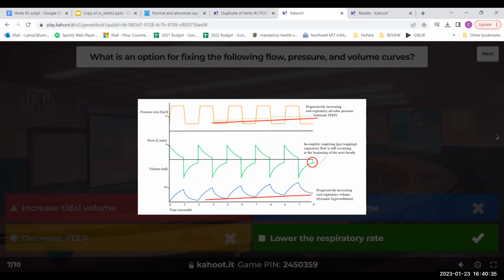When you set the respiratory rate to 20 and you tell the ventilator to give a second for the patient to inspire, how much time are you giving them to expire per breath? A little bit of math, but not very complicated. Anyone? The 2 seconds? Yes. So 2 + 1 would be 3 times 20. It's 60 seconds, which is the number of seconds in a minute.